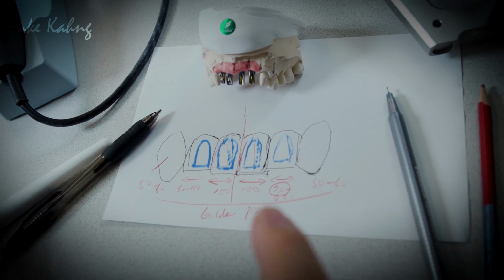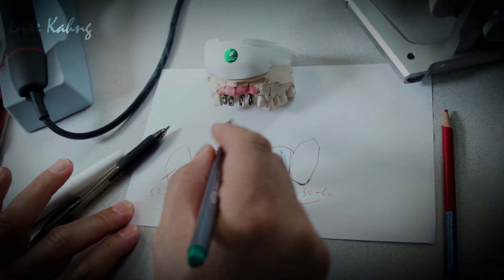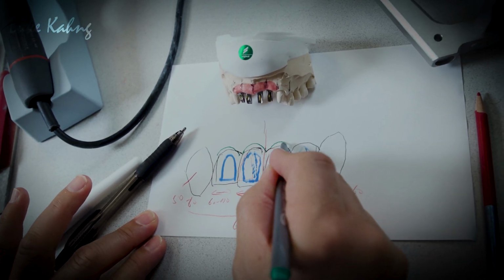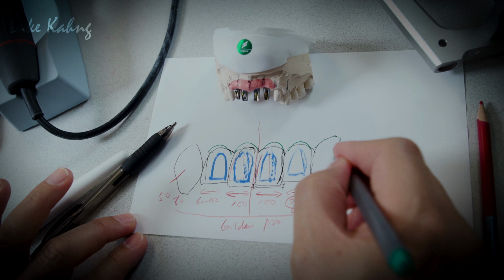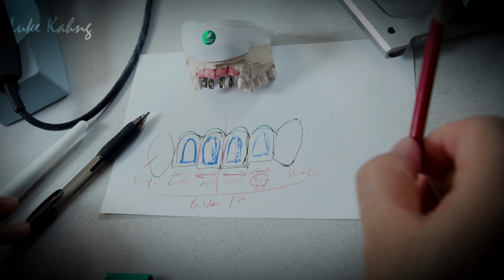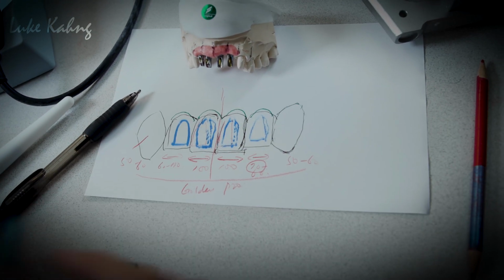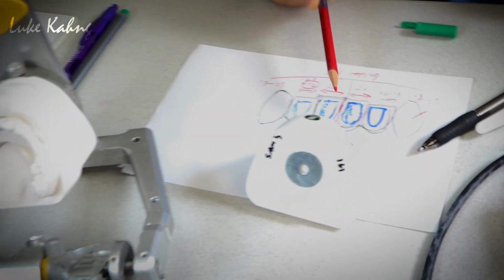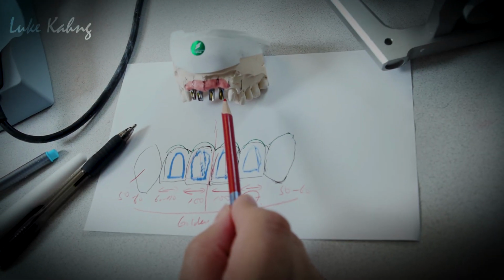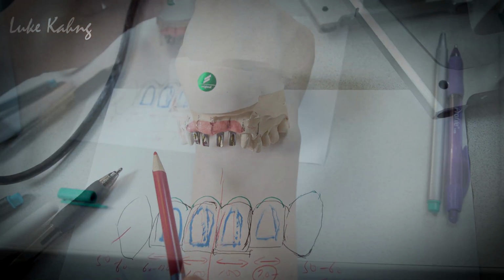It's very important, right? And also, it's very important, I know this is an implant, the tissue line, the tissue design. If we don't set up the tissue design, it will not look good, the final 6-unit cases, okay? And also, you have to get the long axis. Let's concentrate on this. Okay, number one, finish the midline, set the proper abutment inside. Okay, this is wrong, like I said. Then cut it here, and then we change this and move it here and there.